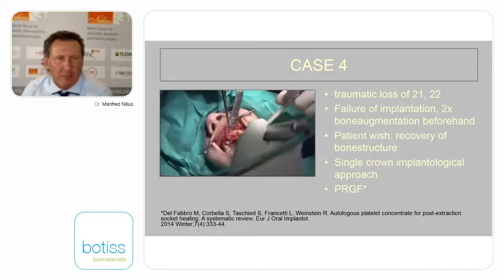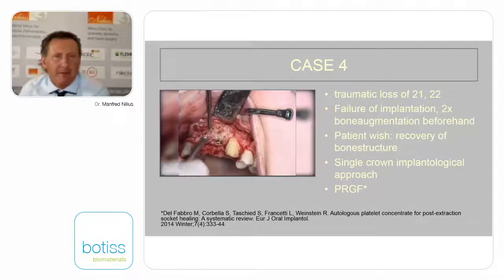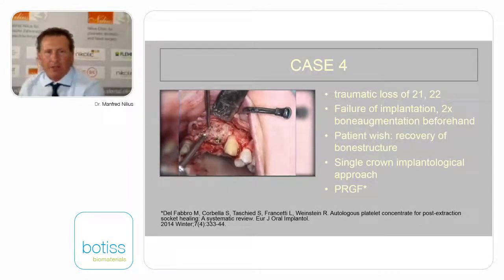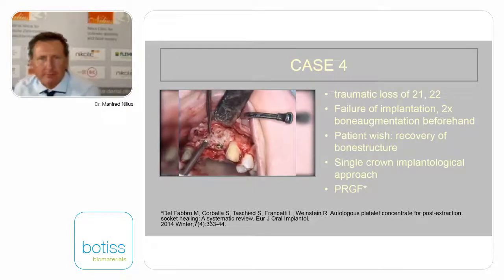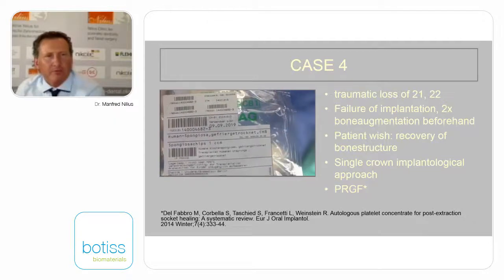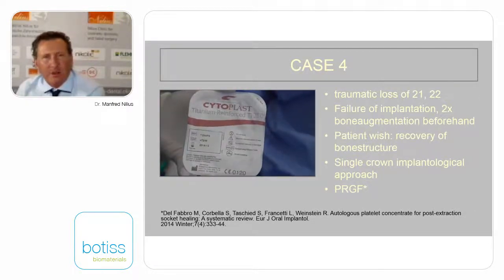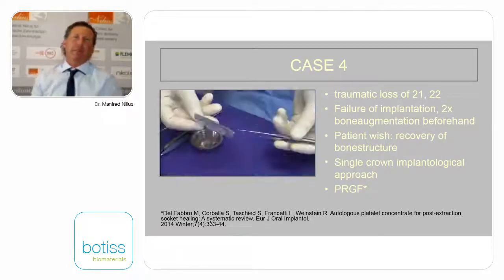Yeah, screw fixation, minimum 2 screws. You can put it also in different directions. And this is the human spongy bone, some chips, and a C2+ titanium reinforced membrane.